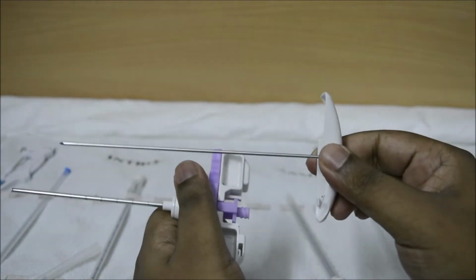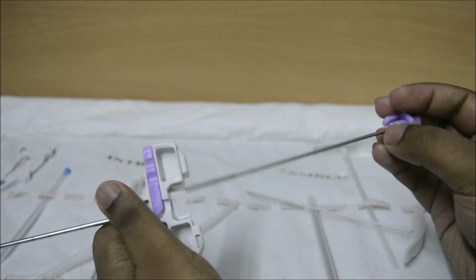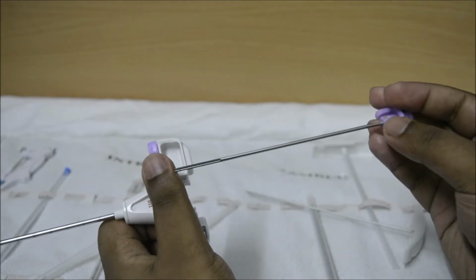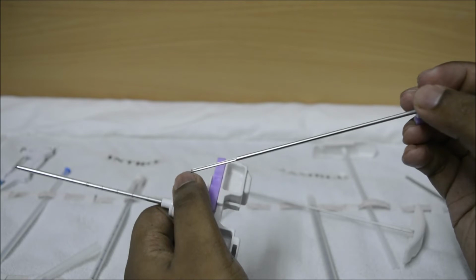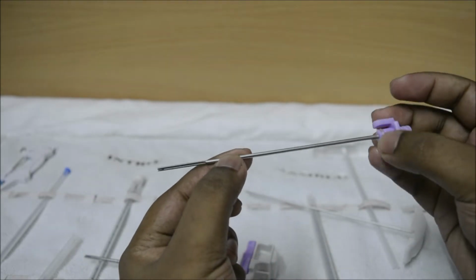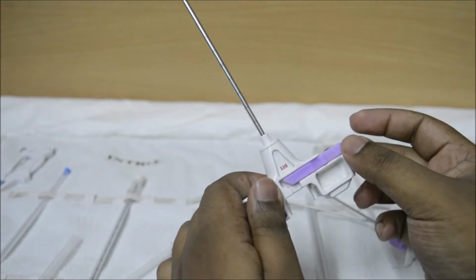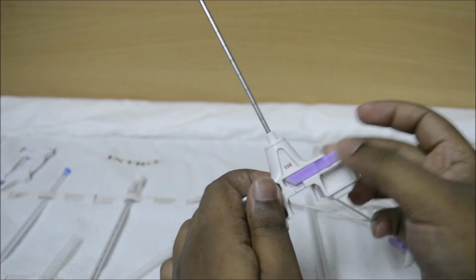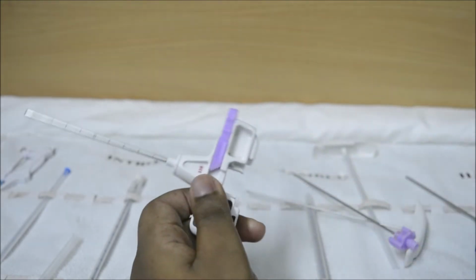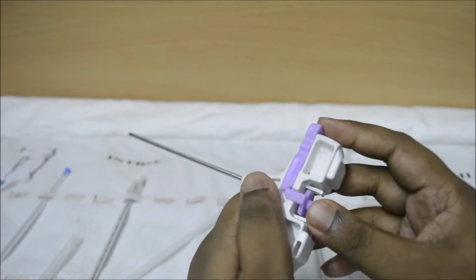Here comes the stylet. Here comes a special form of sample collector. As you can see, the total design of this sample collector is different. It remains inside the needle. And the third part is this locking mechanism, or the bevel push technology. So I will explain how the process is performed.